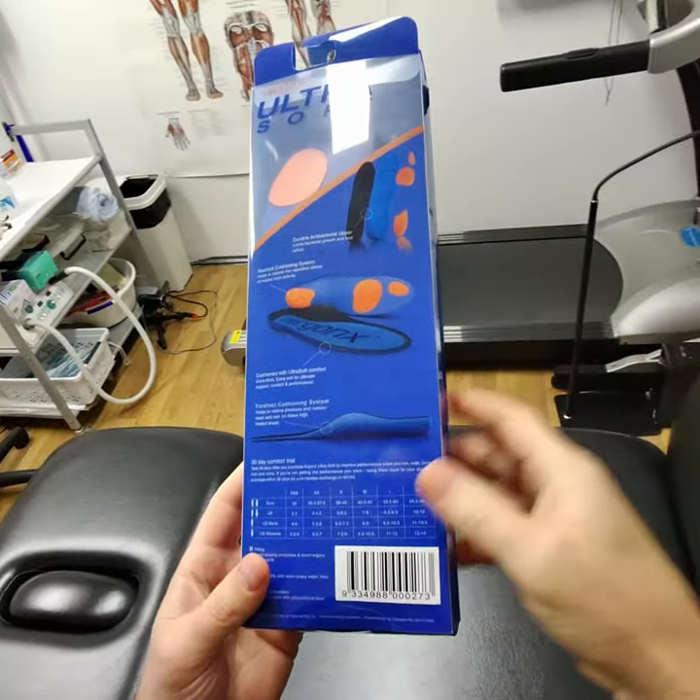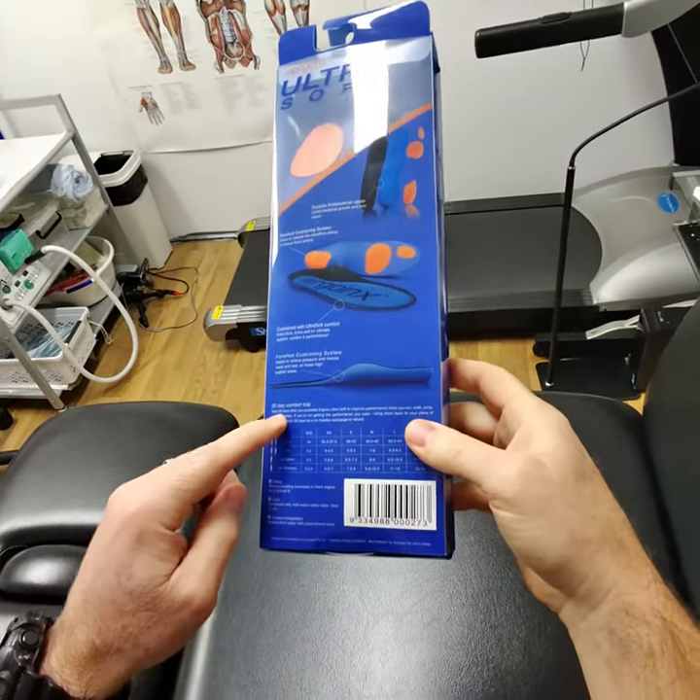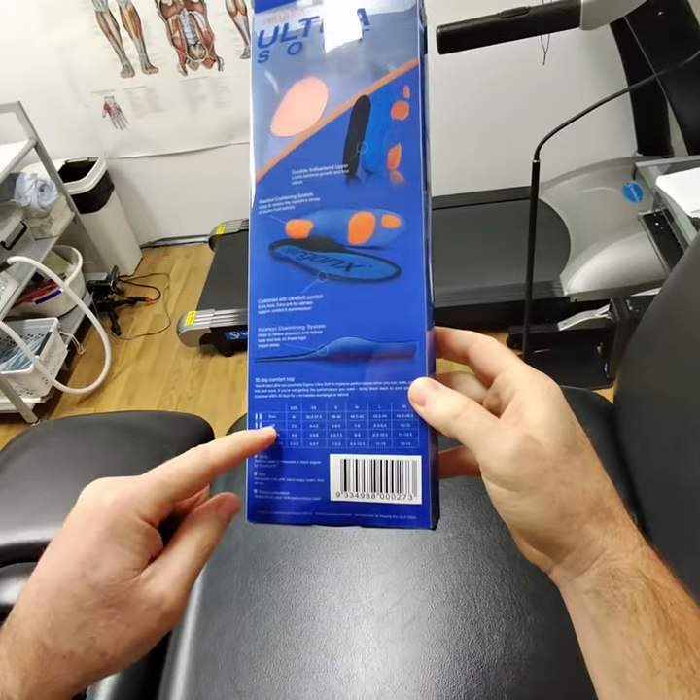It's got a forefoot cushioning system that helps if you're getting pain in the forefoot. It comes with a 30-day comfort trial, and there are enough sizes to fit your foot properly.